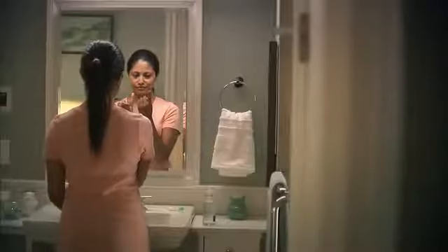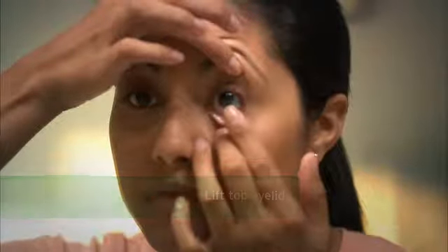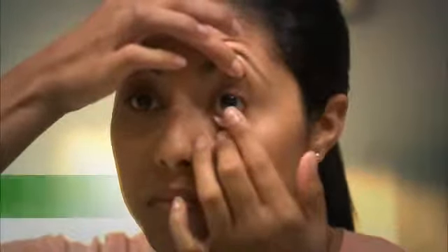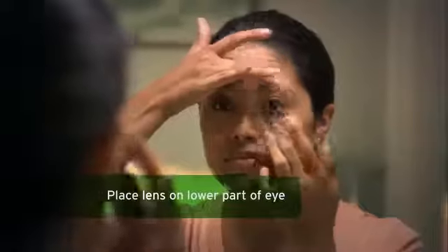Look straight ahead and pull down on your lower eyelid with your middle finger from the same hand. Use the middle finger from your other hand to gently lift your upper lid. Look up and place the lens on the lower part of the white of your eye. Then remove your index finger and release your eyelid. Look down and close your eyes gently for a moment — this will allow the lens to center itself on your eye. You may need to blink a few times to make sure the lens centers.